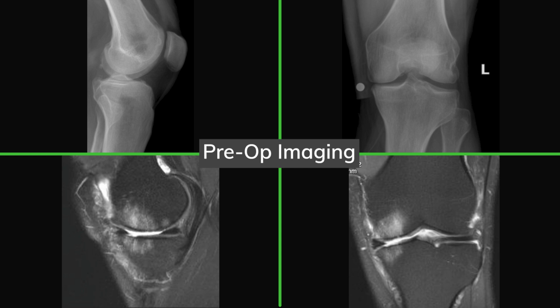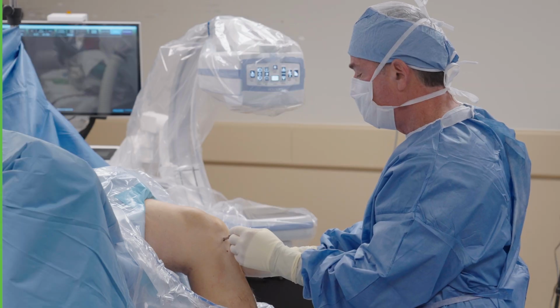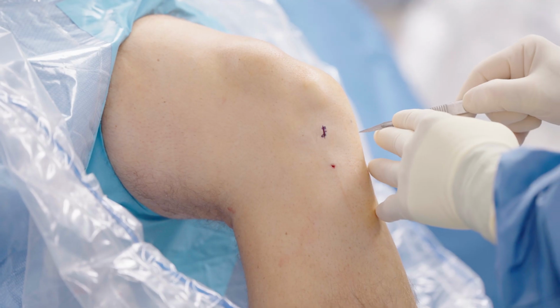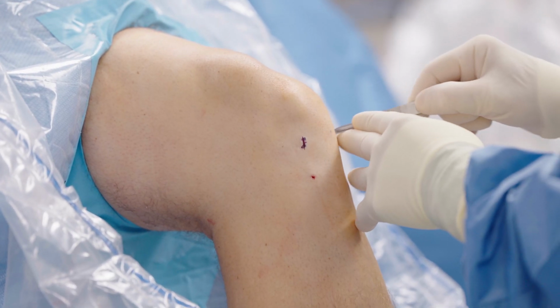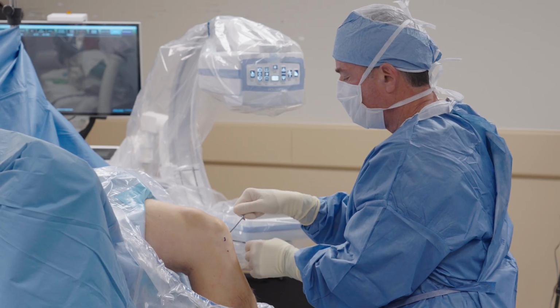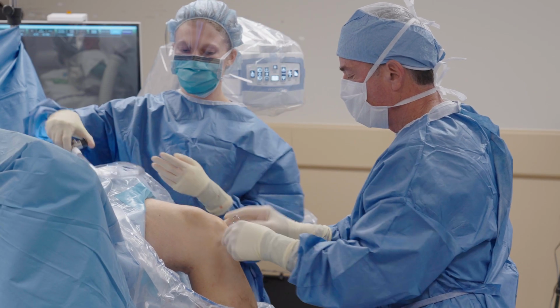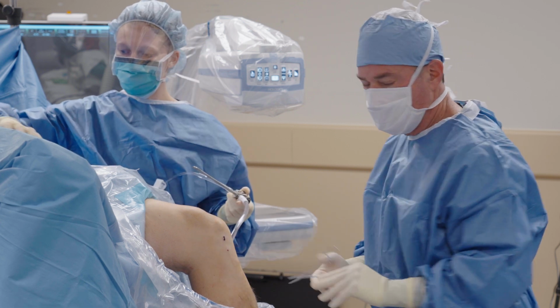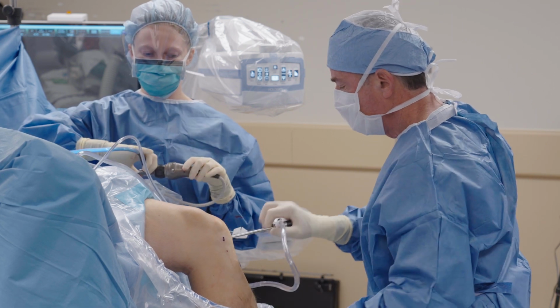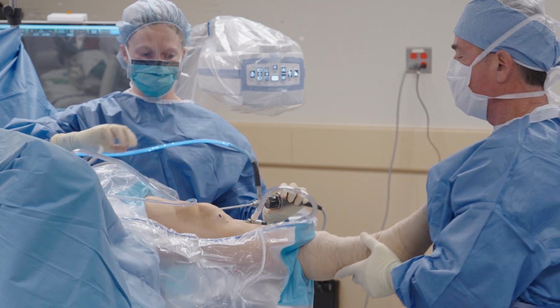The plan today is a left knee arthroscopy, evaluation of the medial compartment. What's unique about his case is that his primary complaint is more bone pain than joint pain, which is essentially an insufficiency fracture of his medial tibial plateau and medial femoral condyle around the anterior third of each. So we'll start with a routine arthroscopy, articular cartilage debridement, meniscal debridement, all in an effort to minimize the symptoms that might be generated from pathology that's present intra-articularly.